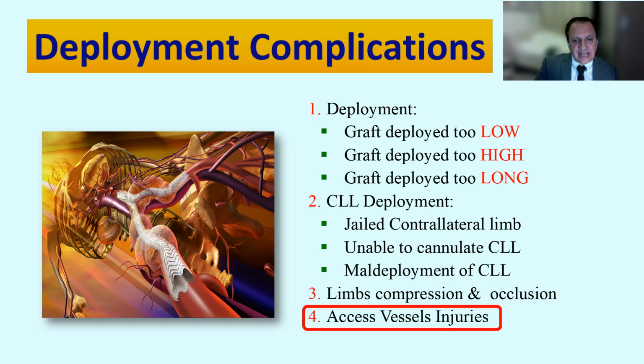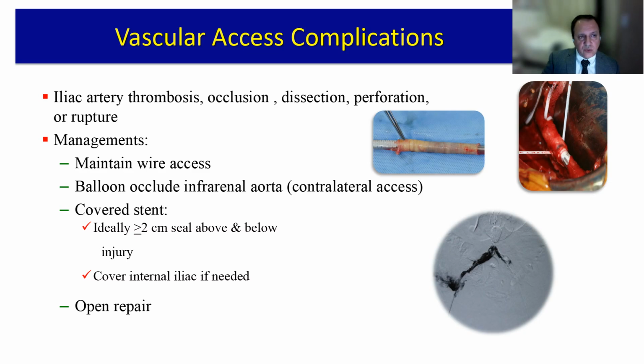The last complication is access injury. You can end with iliac artery thrombosis, occlusion, dissection, perforation, but the worst thing is to end with a rupture, which we call iliac on a stick.